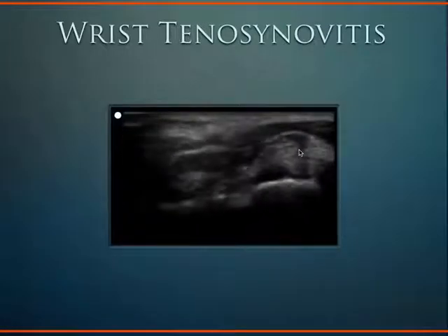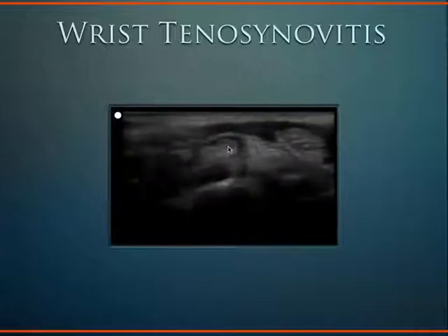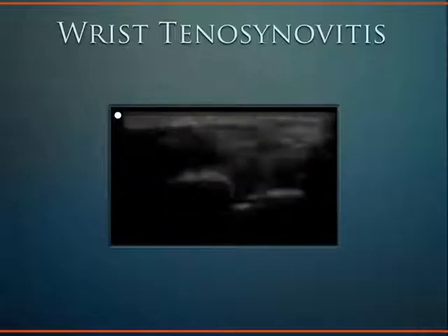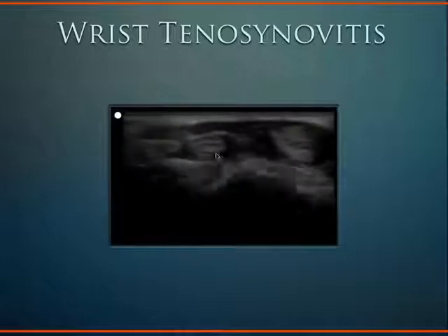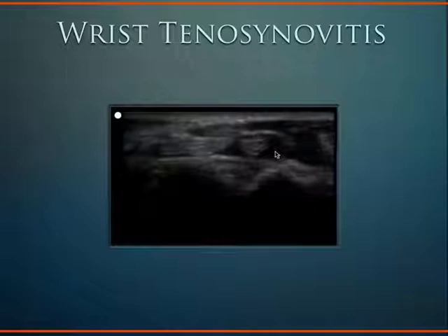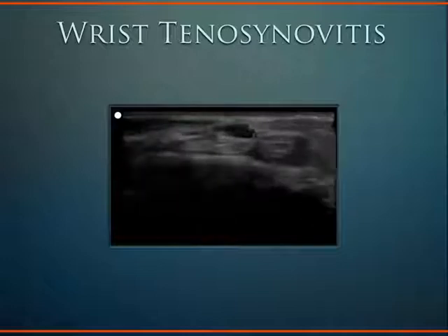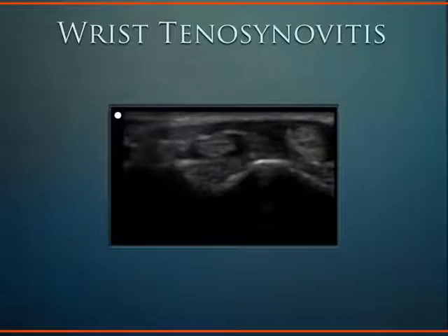Here's a patient with tenosynovitis of the wrist. This is the tendon, and between the tendon and tendon sheath we see some fluid. Seeing fluid like that confirms thickening of the tendon sheath and an effusion — confirming the diagnosis of tenosynovitis and differentiating it from cellulitis. We showed this image to our surgical colleagues and they took the patient for a washout of that tendon sheath.